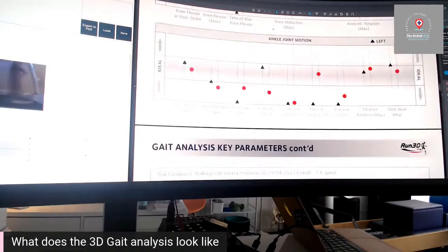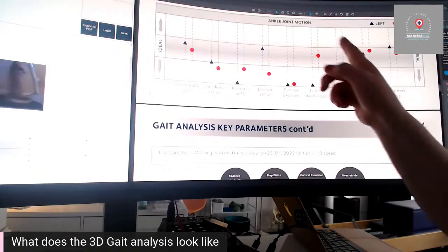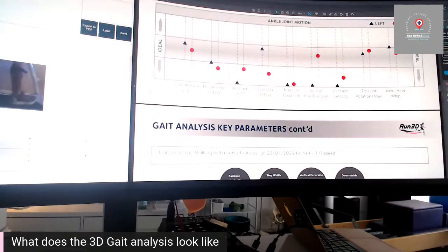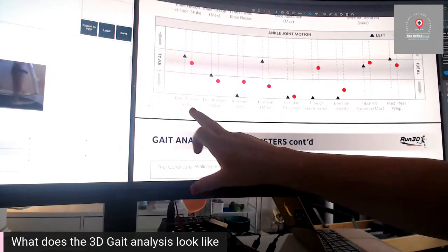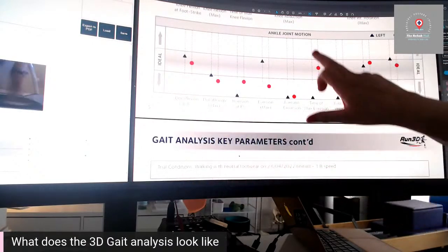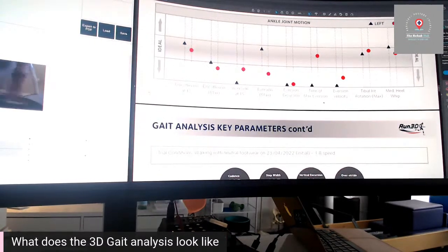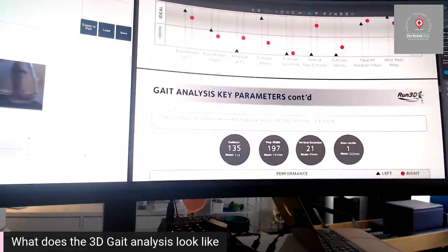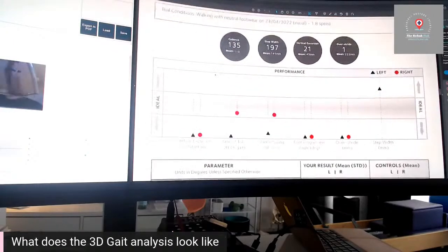And we can see why, as podiatrists, we spend 4 years just looking at the foot and ankle. Well, not just looking at the foot and ankle, but we spend a lot of time really getting to know this area. It's a complex area, and we can see all of these little markers. So this just builds up a big picture based on what issues that patient's had, and it helps us with one, diagnosis, and two, then what do we then do about it.